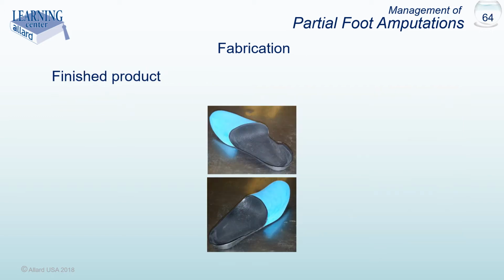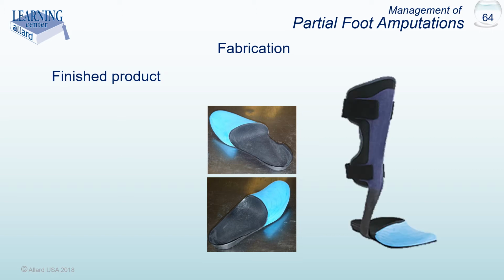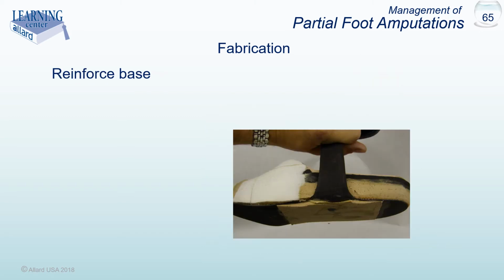The laminations are then shaped to match the shape of the contralateral foot. Once this is accomplished, the prosthesis is affixed to the Blue Rocker footplate with final alignment based on equal pressure distribution of the anterior shell to the tibial crest.